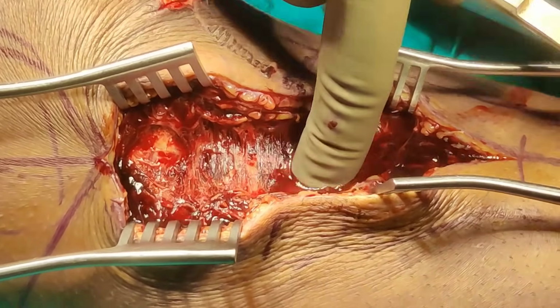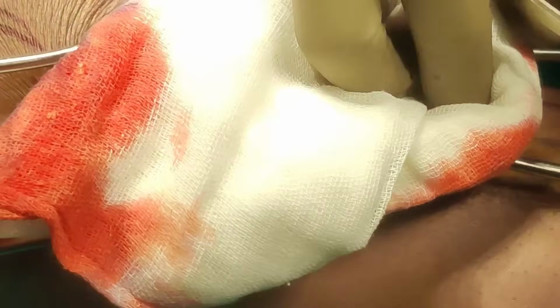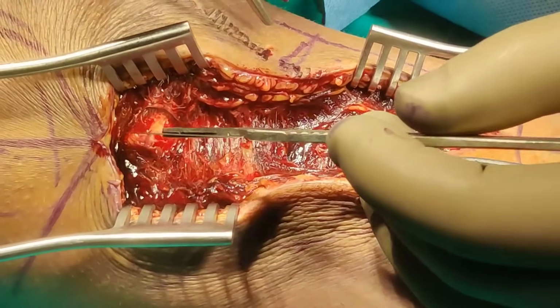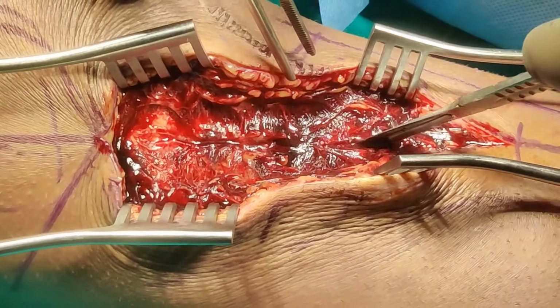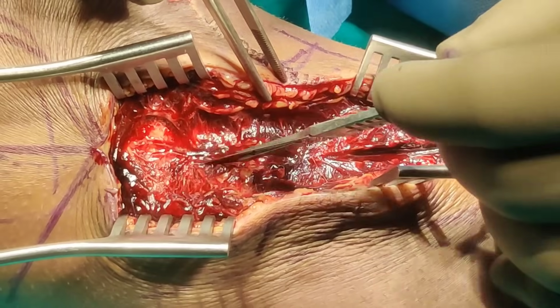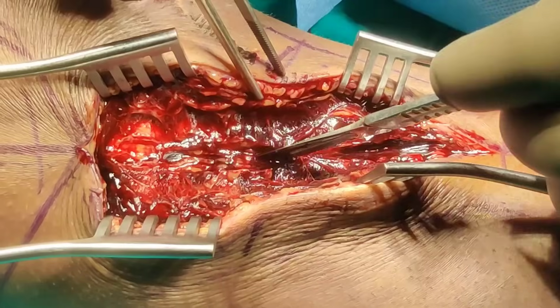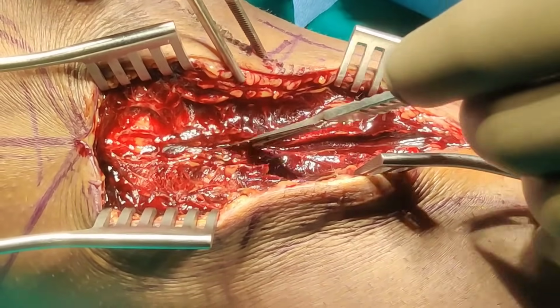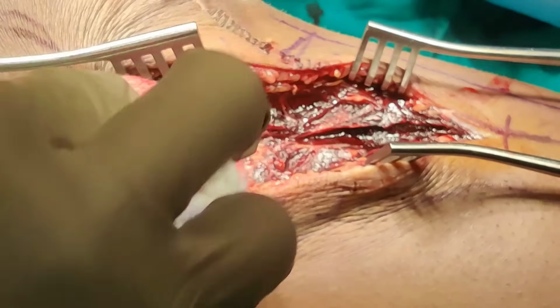So I'm just putting my finger in, and I think this leg is extremely swollen, but our incision is pretty good. So just layer dissection, change your knife, layer dissection. Now normally when you read the approach in books, you find it very easy, but when you come to real life, things are not that straightforward. Can you see the amount of hematoma here? It is very difficult to identify what is what.